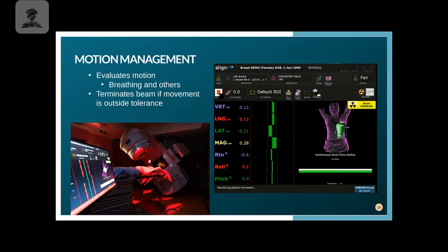I think that'd be awesome for x-ray, because I can't tell you the number of times I've been doing a chest x-ray and somebody starts to talk during the middle of it, or is letting out their breath before they're supposed to. But with this, we are using a red infrared light over here, and we will turn off the rest of the room lights and shine that on the patient's skin, and then it's going to monitor from there.